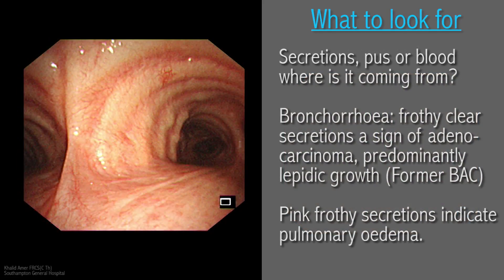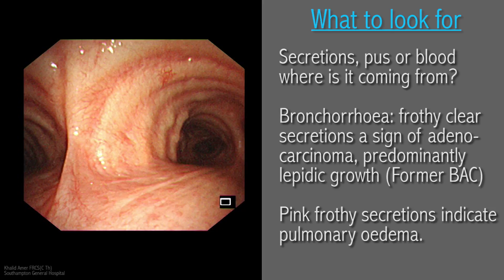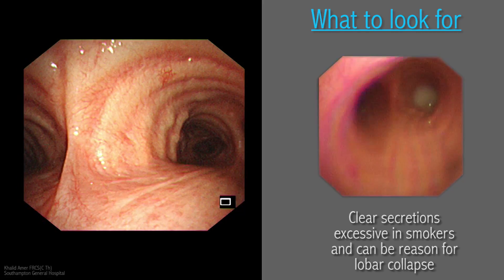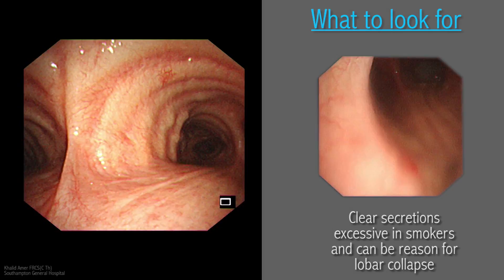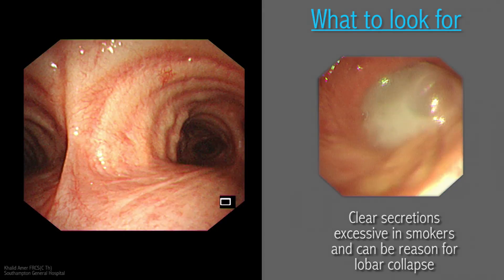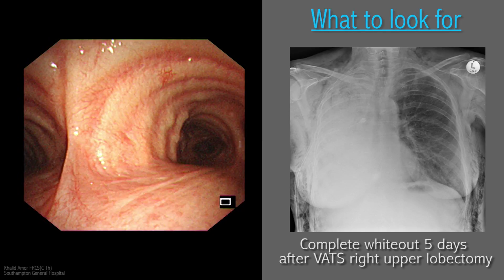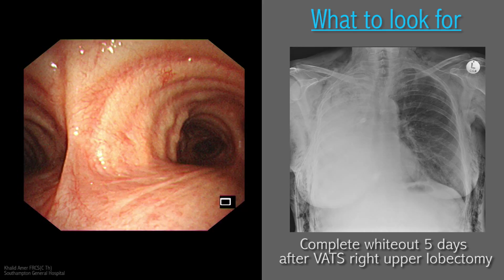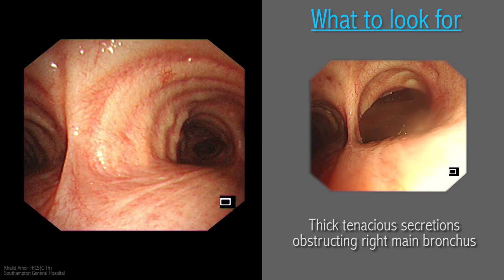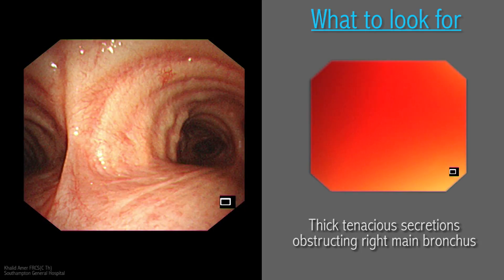Pink froth is usually indicative of left ventricular heart failure and pulmonary oedema. Excessive secretions in a smoker might prompt the decision to perform a prophylactic mini-tracheostomy at the end of surgical resection. Patients with limited lung capacity might not tolerate lung collapse, tipping the balance towards respiratory failure in the immediate postoperative period, requiring escalation to intensive care. His postoperative chest X-ray showed complete whiteout five days following VATS right upper lobectomy, and the situation was salvaged by bronchoscopic suction and lavage under general anaesthesia.